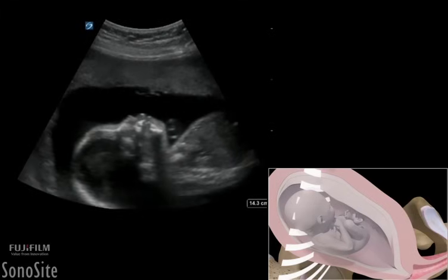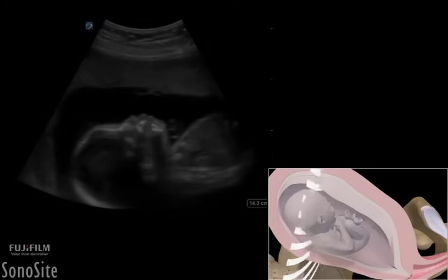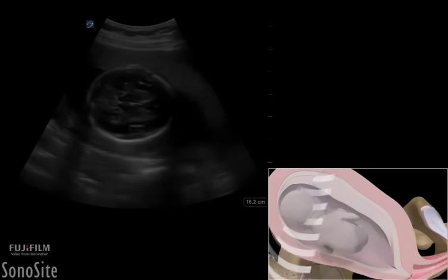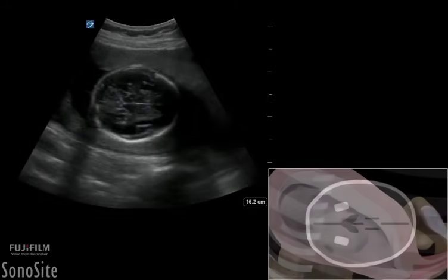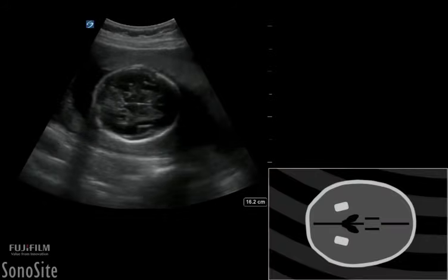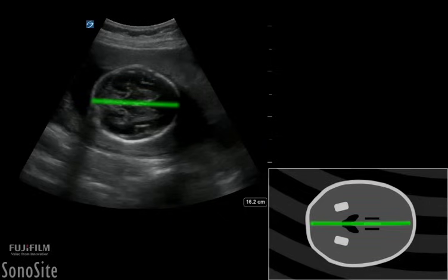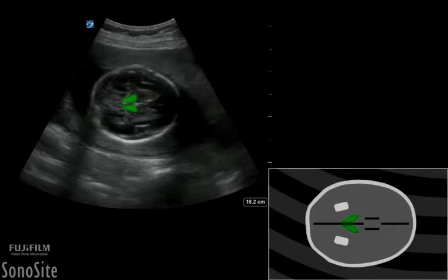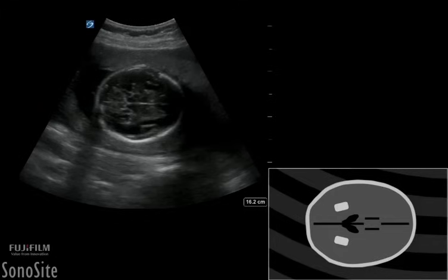After identifying the fetal head, the transducer is moved to obtain a cross-section of the fetal skull at the level where the falx cerebri is midline. The thalami are symmetrically positioned on either side of the falx, and the cavum septum pellucidum is seen in the distal third of the fronto-occipital diameter, giving an oval, symmetrically positioned skull.